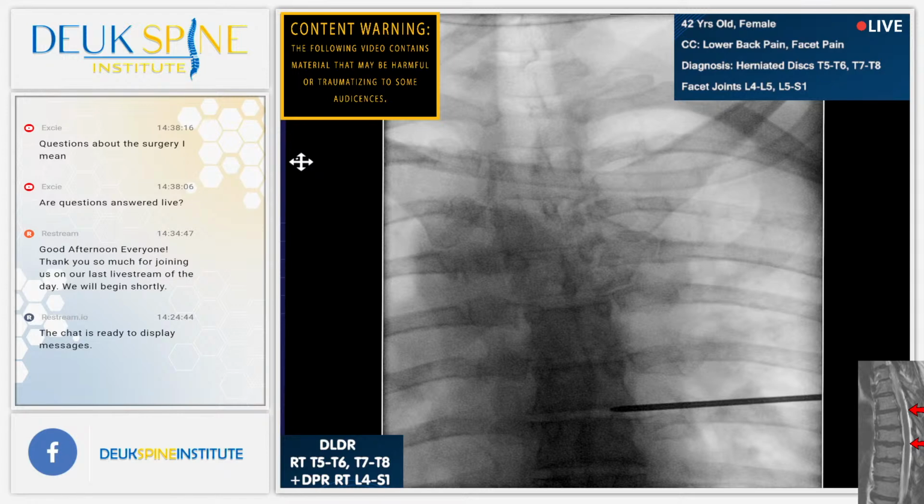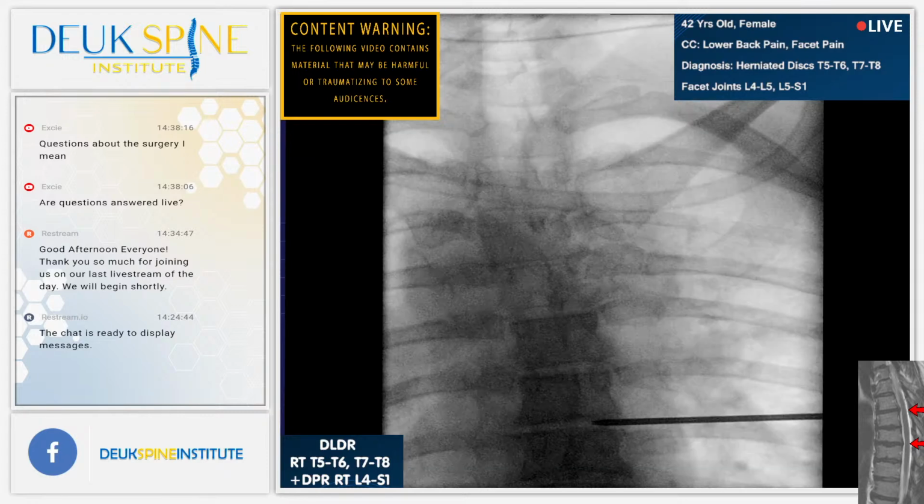Let's see if we can clear up our counting a little bit better. All right. I angled a little bit more, but it didn't change anything. Well, I want to see the first rib, so I need you to zoom in a little bit more. I mean, if that's first rib, it's hard to tell if that's first rib.